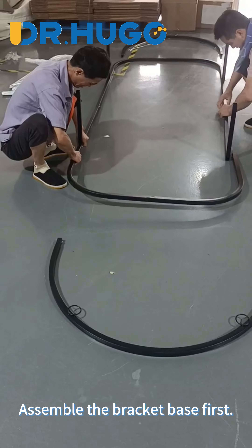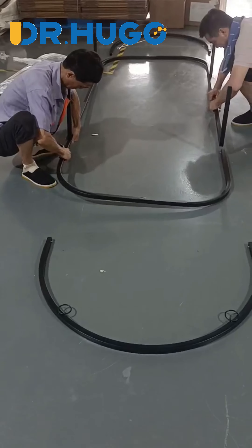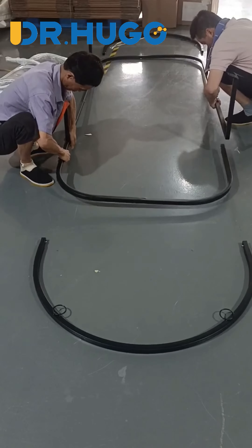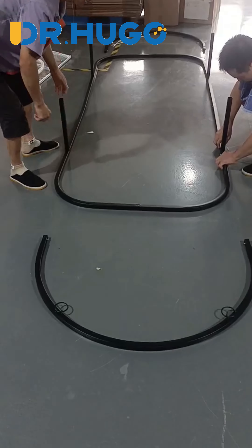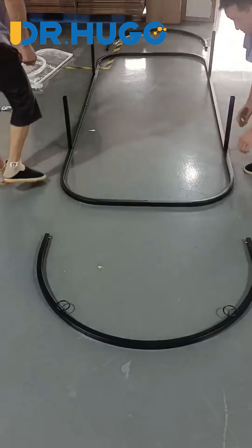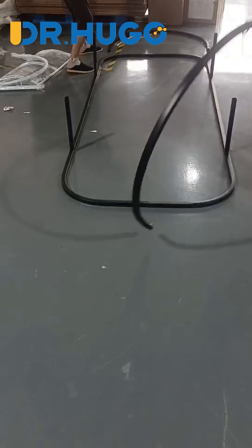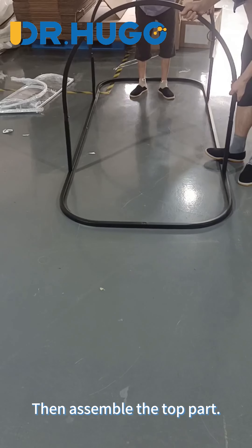Assemble the bracket base first. Then assemble the top part.